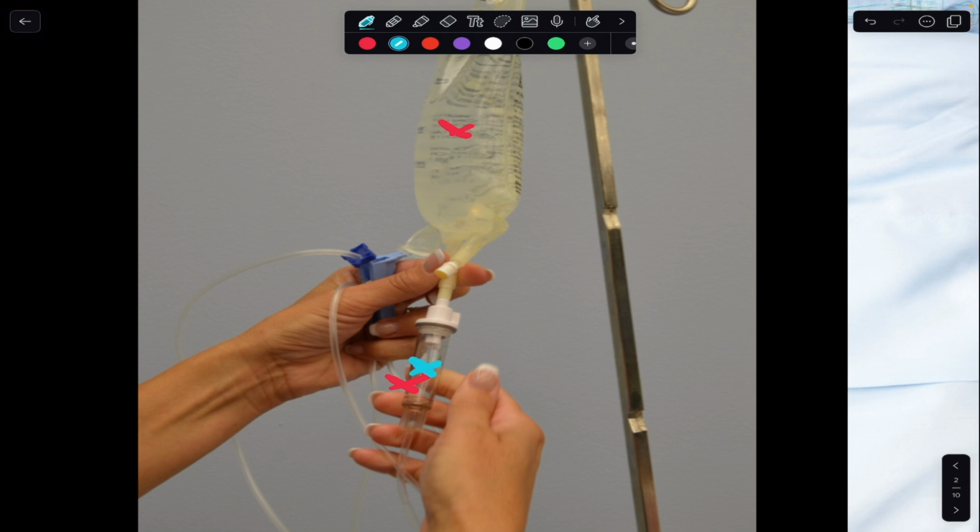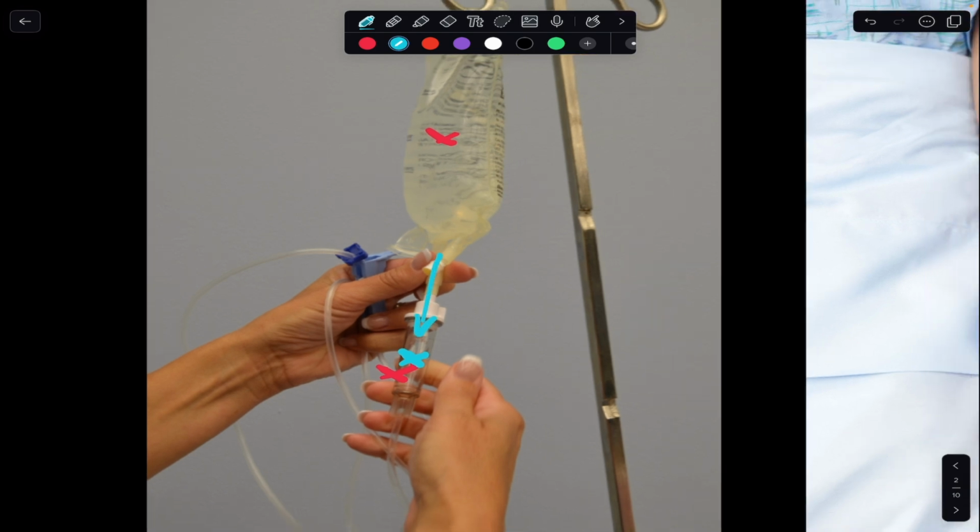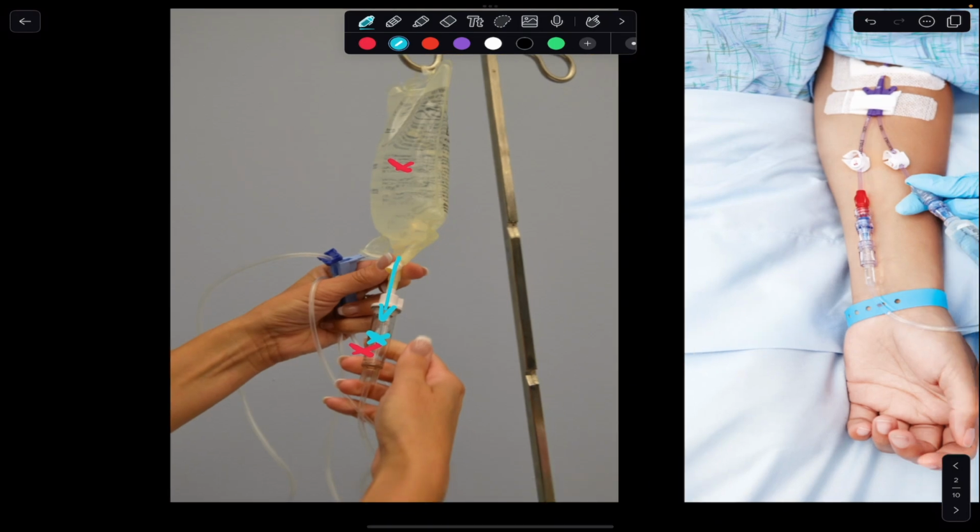Then you would squeeze this drip chamber, and as that reinflates, it's going to provide suction that's going to draw the fluids down into the drip chamber. And then you wait maybe 30 seconds or so as fluid begins to flow through the line until it flows all the way through the line. Watch for bubbles. As soon as you see that there's not too many bubbles left in the line, then you can clamp. Right here would be a clamp. You can clamp your tubing and stop the flow through the line. So the whole purpose was, one, to get the tubing attached to the fluid set so it's ready to go, and two, to remove the air from the tubing.